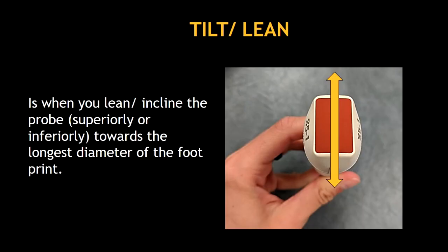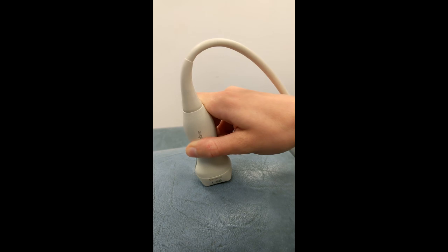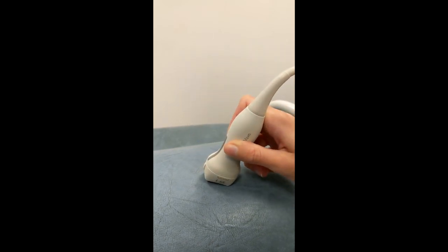And finally, tilt. This is when you lean or incline the probe towards the longest diameter of the footprint. You can tilt the probe superiorly or inferiorly. Here you can see how I'm tilting the probe up and down.